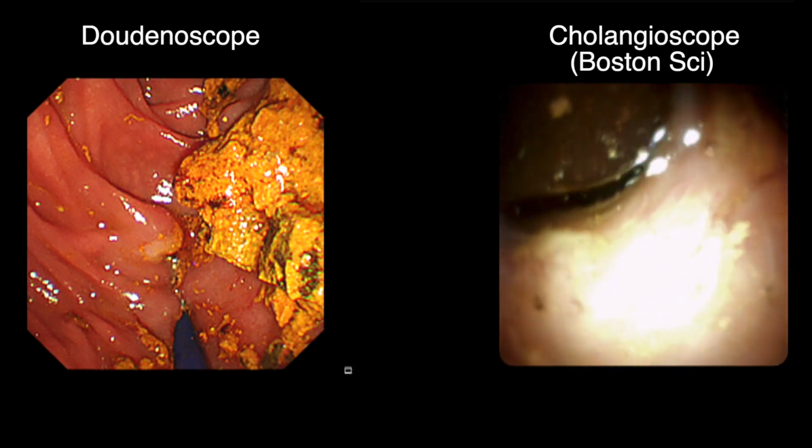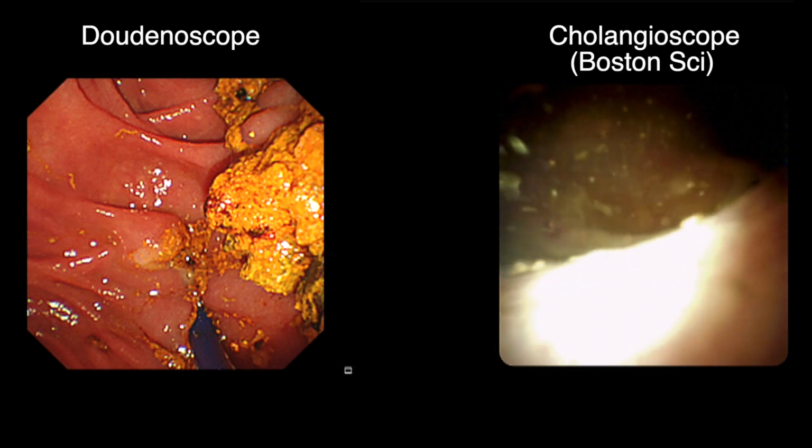The tiny fragments that can be seen should pass out spontaneously via the sphincterotomy.